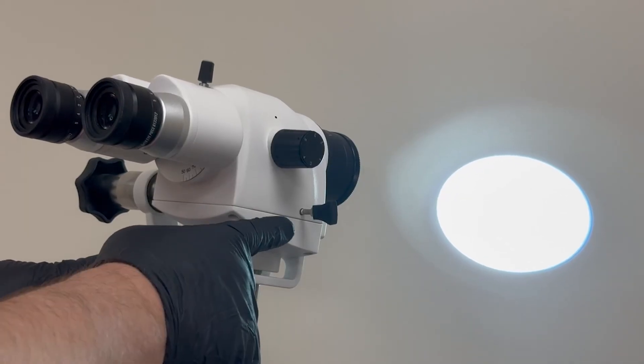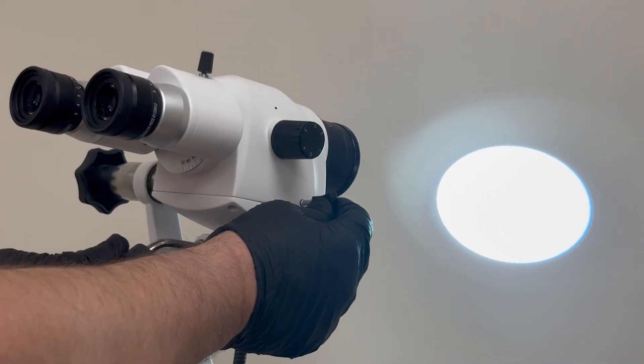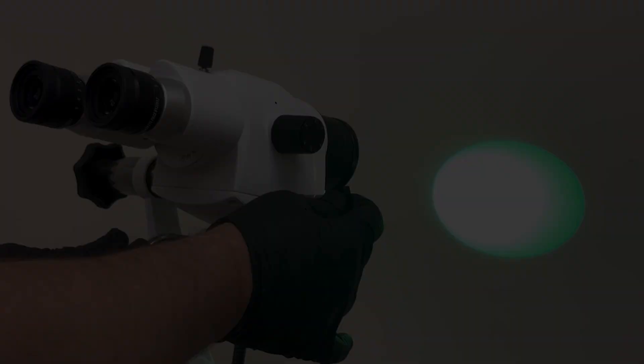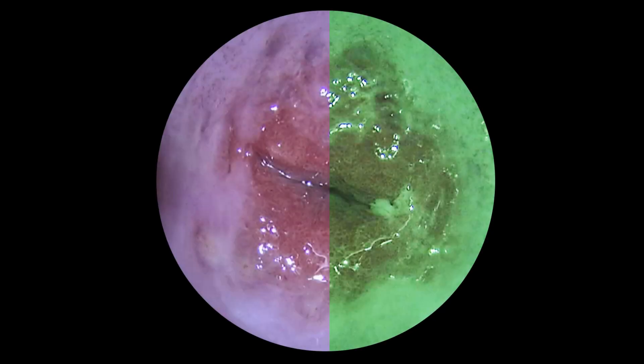All Siler Colposcopes are equipped with a green filter, integrated through a user-friendly push-pull mechanism. This improved contrast provides doctors with a clearer, more detailed view of the vascular structure.